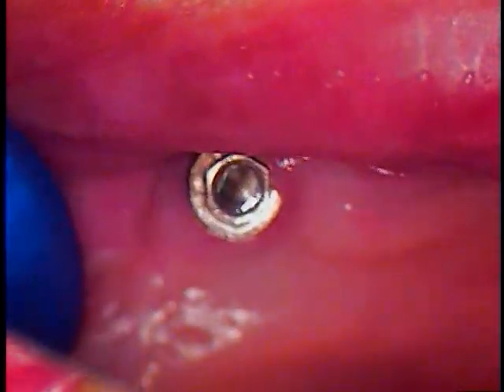This is Dr. Jerry Cuomo. We're live again, just to wrap things up, to go over the case that we just completed successfully.